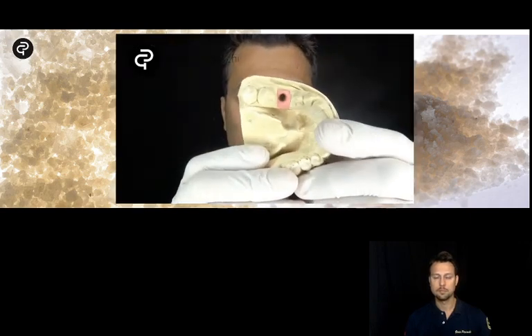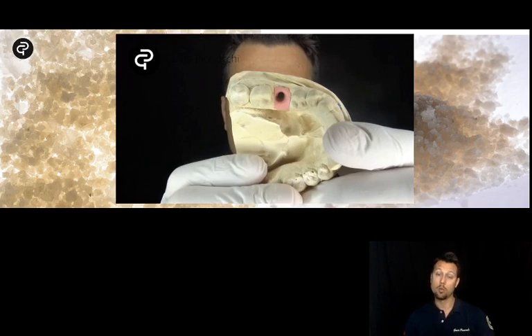Then the analog is surrounded by chalk, and we have what we call the working model in the analog way. It's very important that if you work with polyether, you don't screw the analog inside with the transfer, but wait not less than 24-48 hours to let the impression material complete its polymerization. So it should be screwed in the lab after 1-2 days.